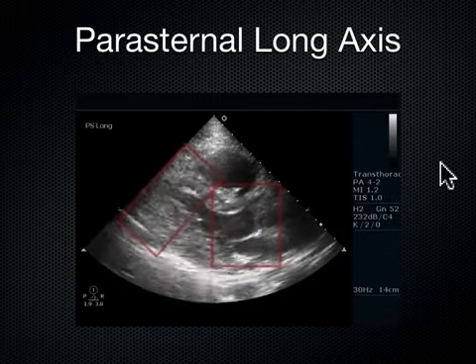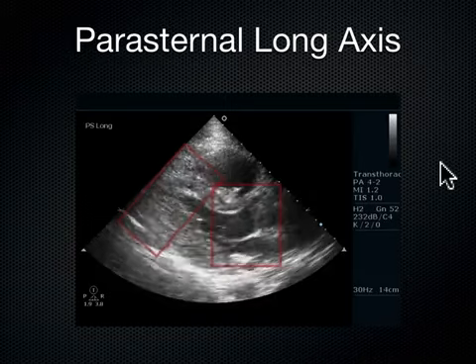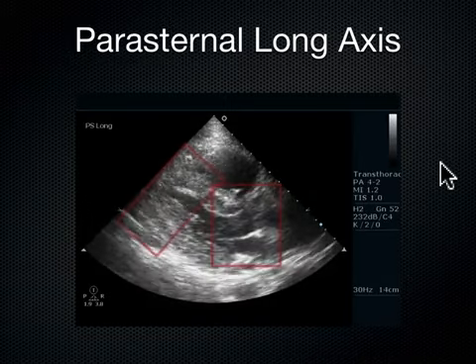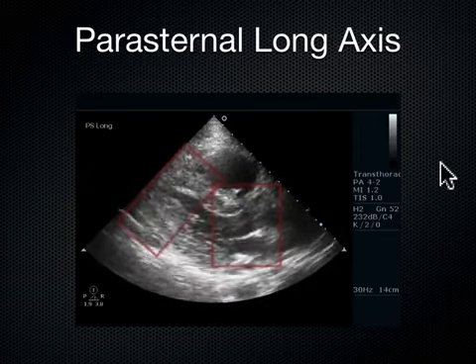And in certain settings, this is a problem because when we see somebody with a large right ventricle, normally the right ventricle is only 2/3 the size of the left ventricle. When someone gets a right ventricle that gets as big or even bigger, like in this case, than the left ventricle, that's a sign of right ventricular strain.